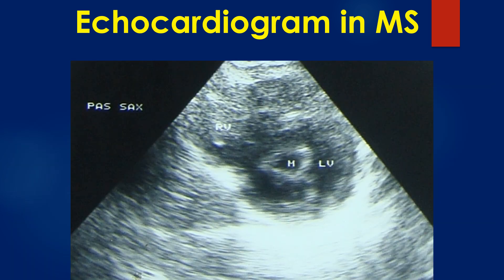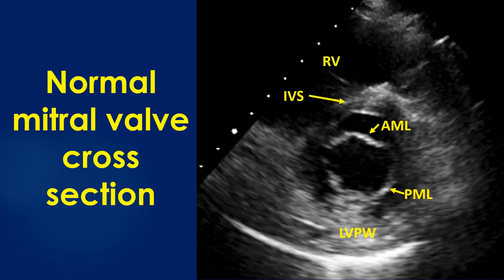The parasternal short axis view in mitral stenosis shows the fish mouth appearance of the mitral orifice in cross section. A normal mitral valve cross section is shown for comparison, demonstrating the anterior and posterior mitral leaflets widely separated. Scallops of the mitral leaflets are also visible, more clearly in the posterior leaflet.